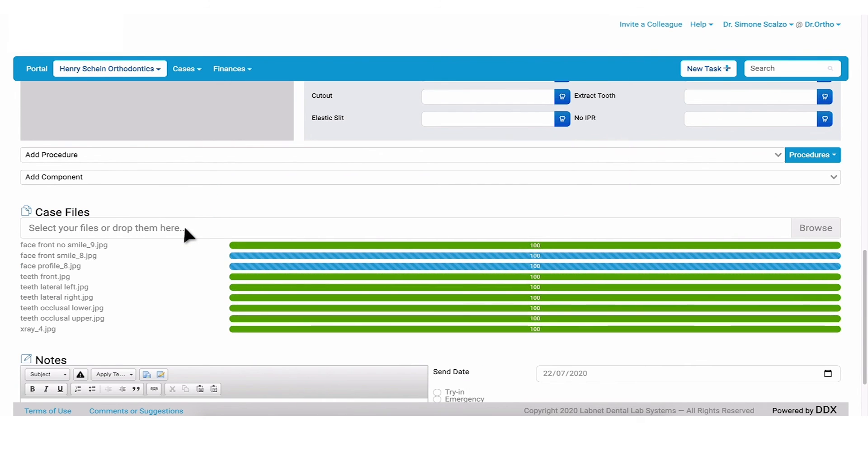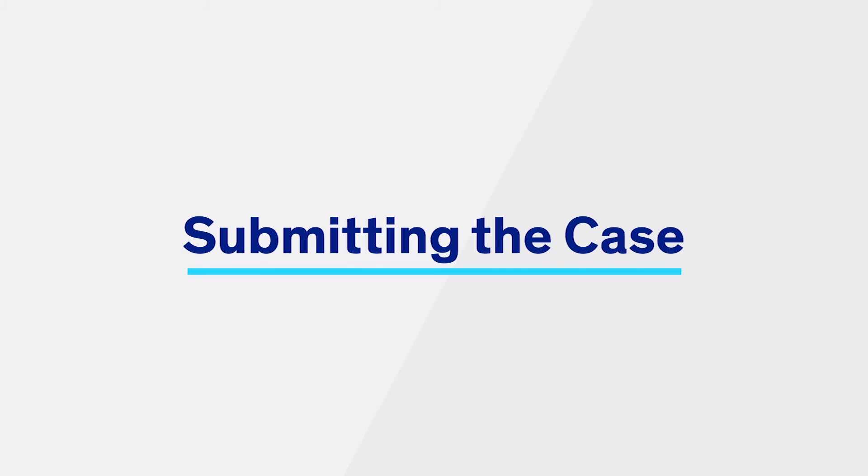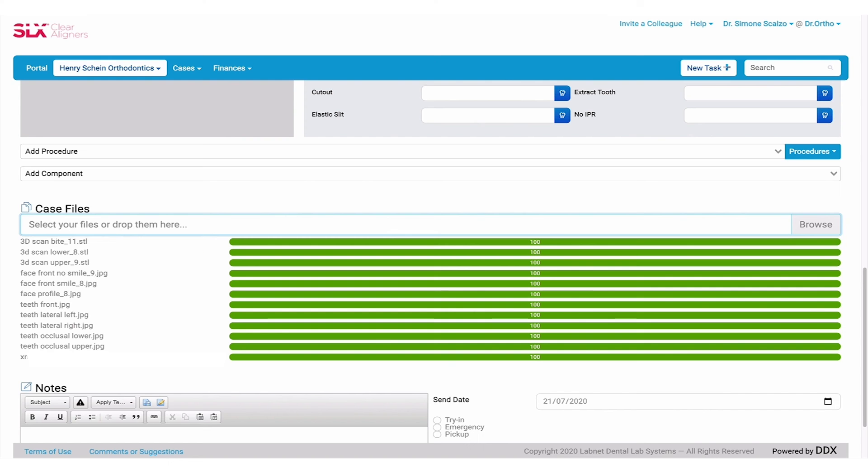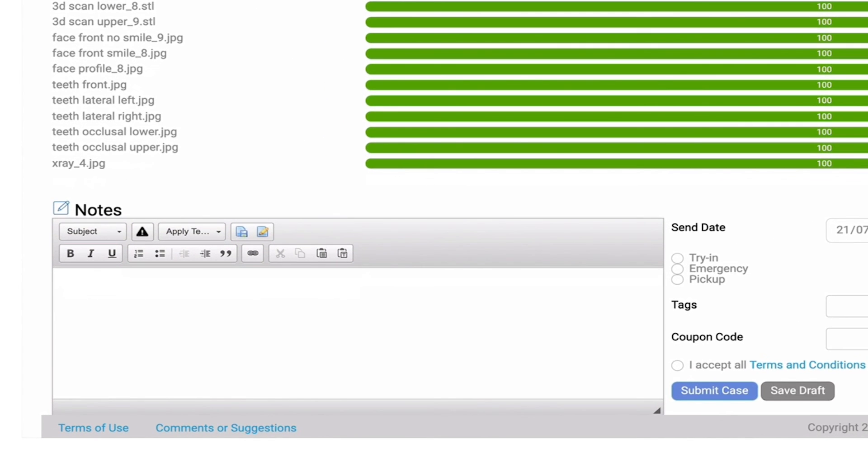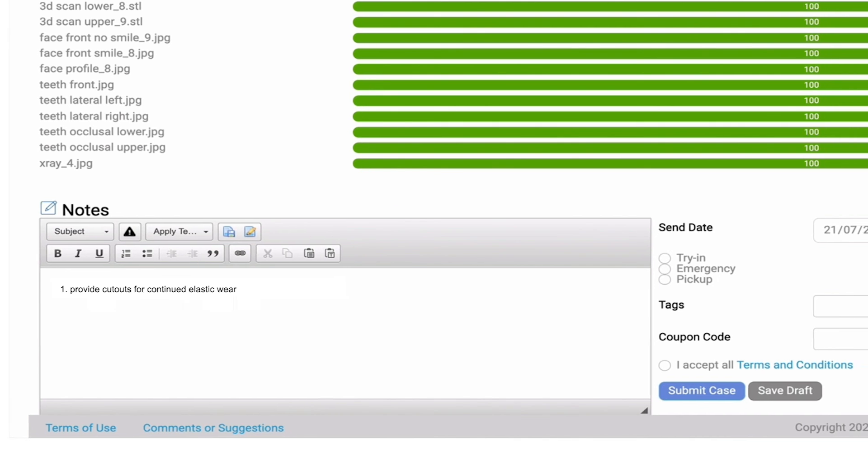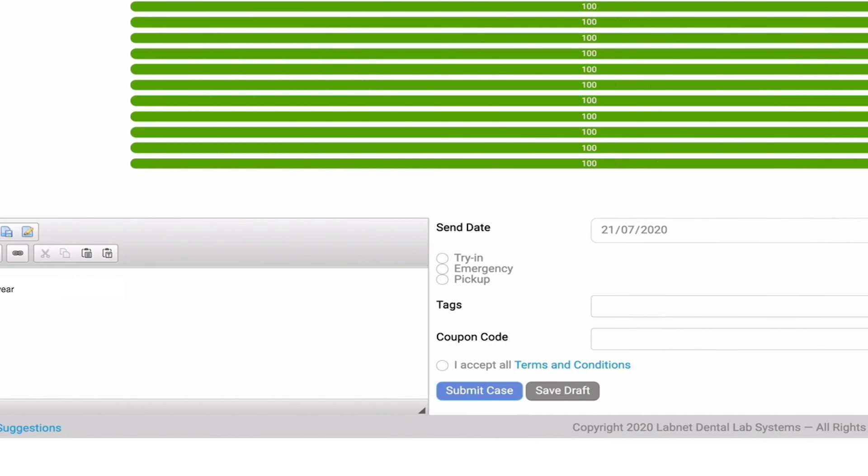You will see a progress bar for each upload. Ensure all files are at 100% before proceeding. Once you've uploaded all the necessary scans and photos, you can add additional treatment instructions and expectations in the Notes box. When you are ready to send the case to the lab, click Submit.